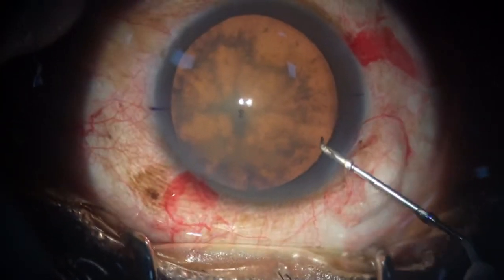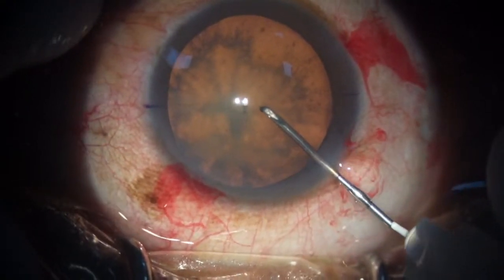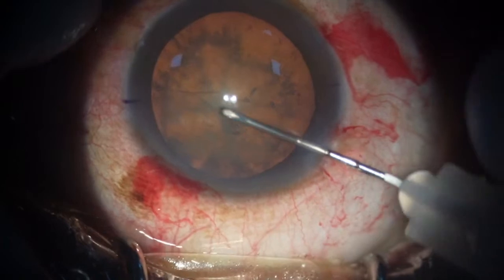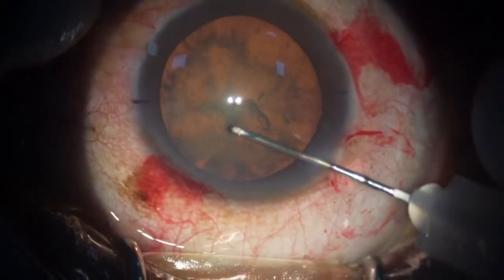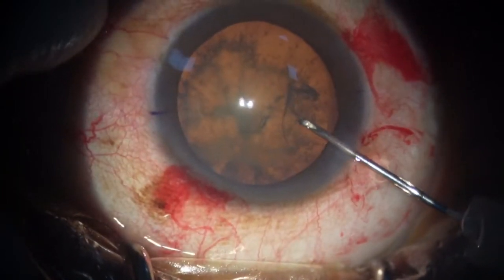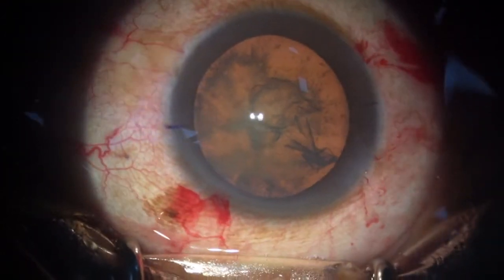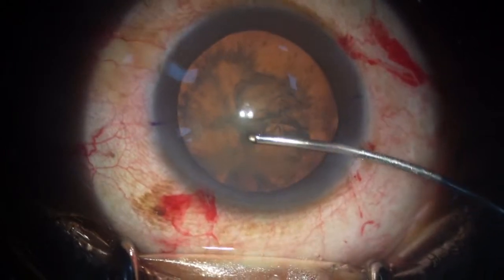So mine is a biplanar because I don't make a groove. I go in straight and then I dip. So it's 5 millimeters. In fact, I've gone a little outside my mark in one area now, and it helps you to remain in place and get the right size, the right shape, the right centration and the right overlap as well. So in many ways, when you're doing premium IOLs, it helps to ensure that your rhexis is rightly centered, right size, right shape as much as you can.